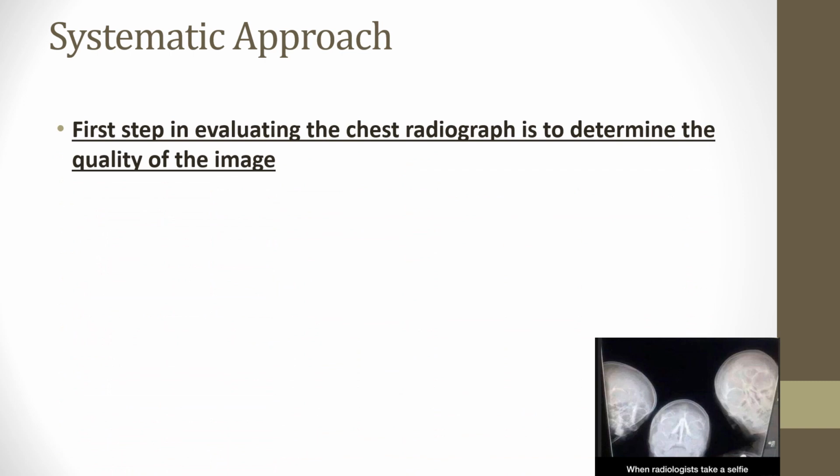All right, the systematic approach. If you haven't seen my previous YouTube video, the chest X-ray evaluation video, please go look at that. I go into detail about a systematic approach to looking at X-rays, and hopefully that will be helpful to you. I'll just brush on it a little bit here. The first step is to determine the quality of the image.